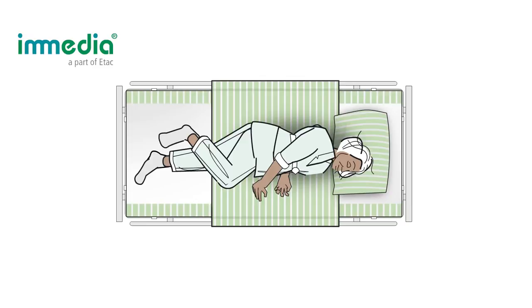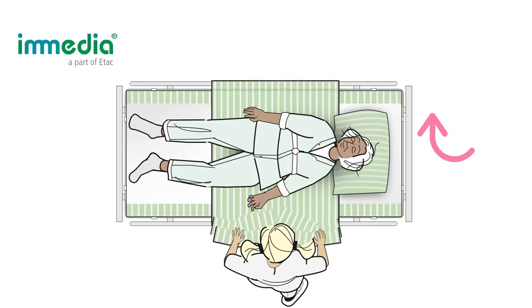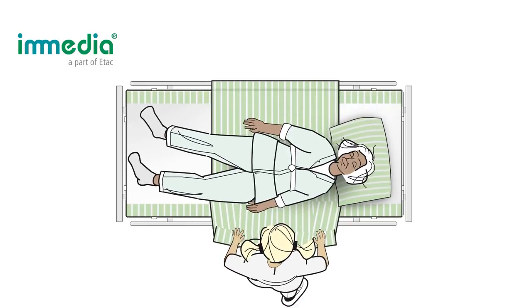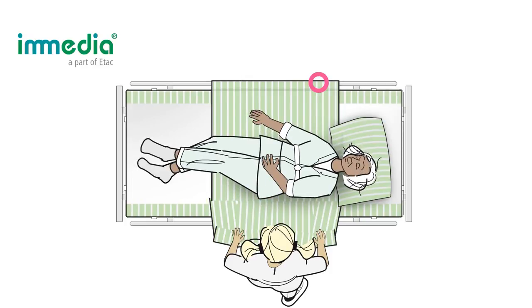When the user is partly dependent and needs to be turned in bed, use the draw sheet to center the user in the bed. Grasp the draw sheet and pull the user gently towards you. If possible, ask the user to cross their arm toward the opposite side of the bed.